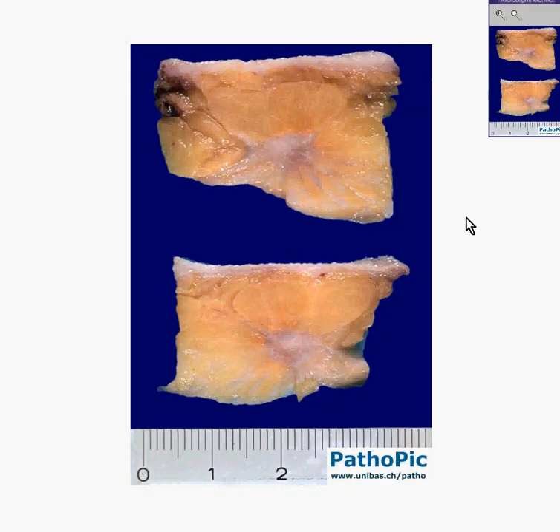Perhaps by now you may be wondering how the word cancer got its name. As you know, cancer is the zodiac symbol for a crab, and crabs have little claws that extend out from their body. Here is a cancer of the breast. It is the most classical, typical type of infiltrating cancer.